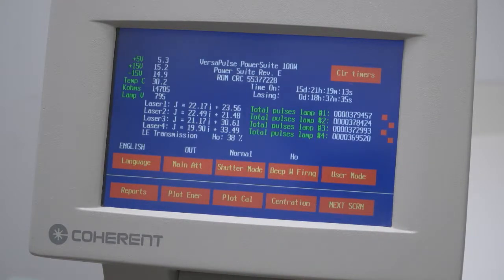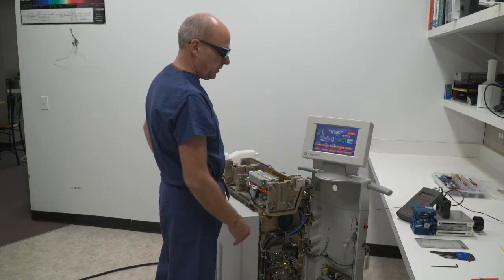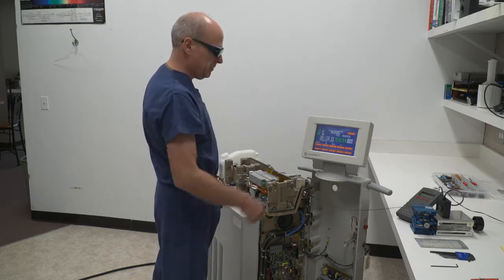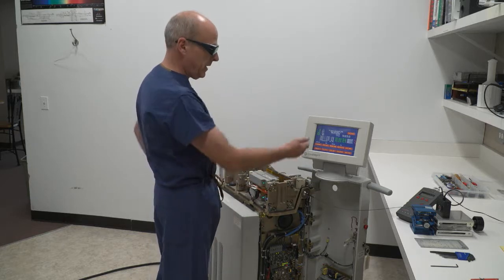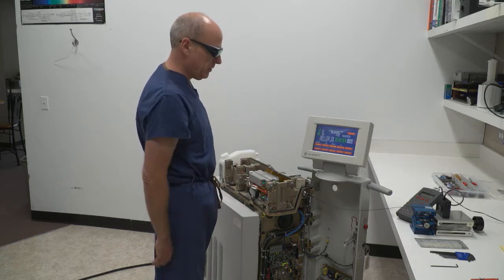The next screen allows me to look at the number of pulses on each brick, how much time is on the laser, low volt supplies, the condition of the water which should be clean because I changed the filters already. I have 15 plus meg of resistance which is fantastic.